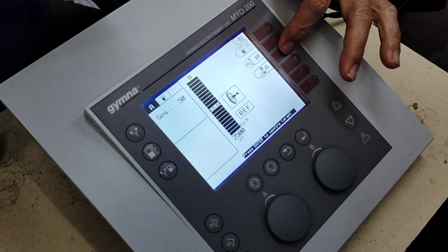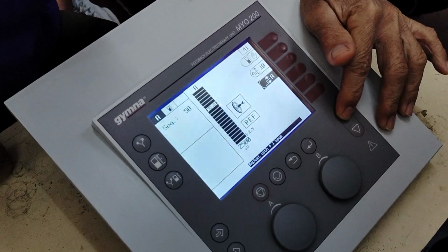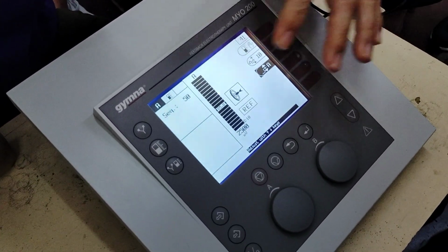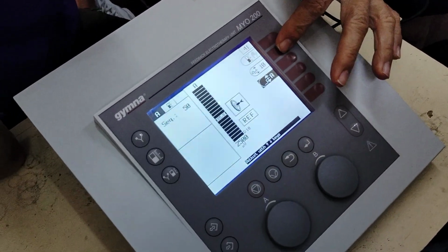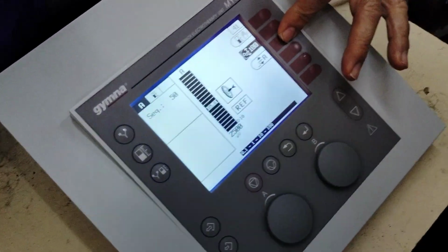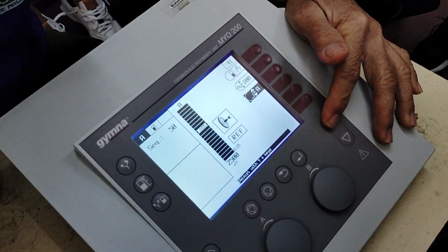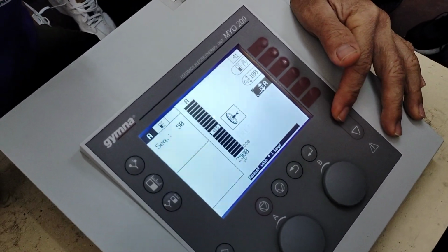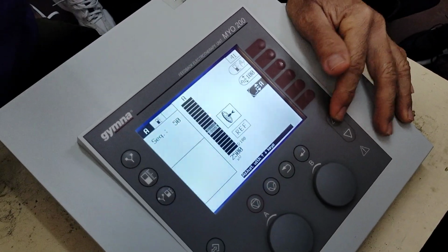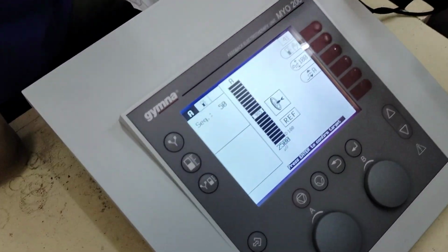For example, when you increase it, you observe 25 increasing by 10: 35, 45, 55. If you want a larger gap, you can change it again. So you probably have 100, and you change it, so it goes 185, 285, 385, 485, 585, 685, 785. Let's just say you have already decided.